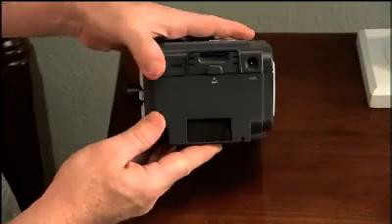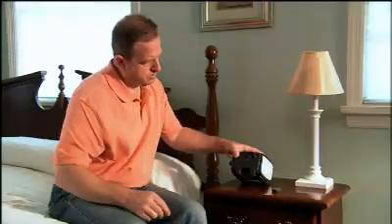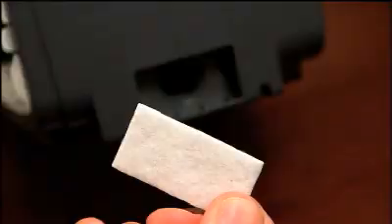Before connecting any components, make sure that there is a filter in the back of the device. A reusable gray foam filter that screens out normal household dust should already be inserted. If it's not, you will need to insert one. An optional disposable ultrafine filter can be added to screen out very small air particles, like tobacco smoke. This filter is especially helpful if you're sensitive to dust and pollen.